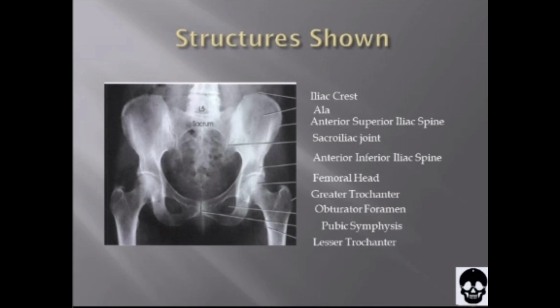both greater trochanters equidistant to the edge of the radiograph, lower vertebral column centered to the midline of the radiograph, symmetric obturator foramina, ischial spines equally demonstrated, symmetric ilia, sacrum and coccyx aligned with the pubic symphysis.